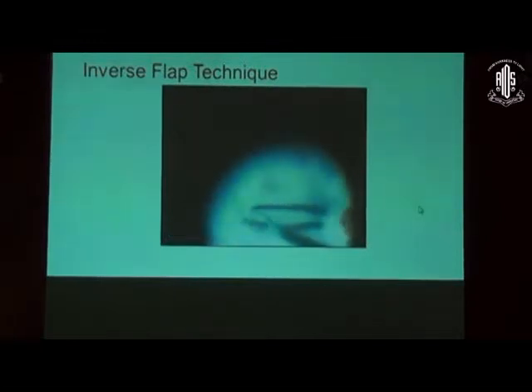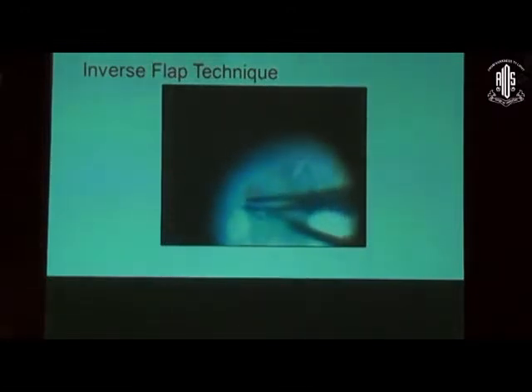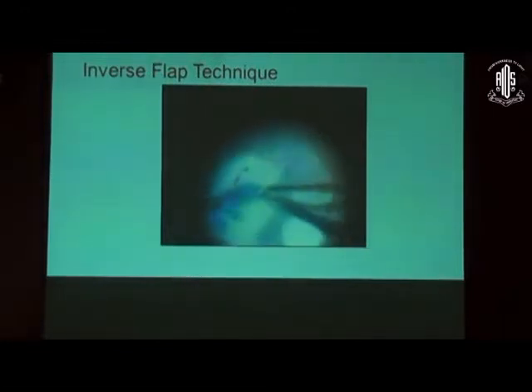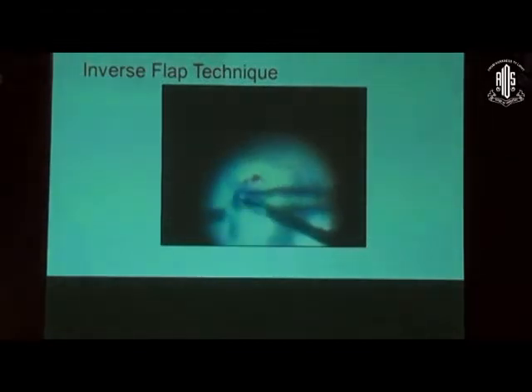So here we make the ILM peels just like a flower petal. So just make multiple peels. You go to the base so that you will have a nice flower petal appearance. So go up to the edge of the macular hole. So like this you can go all around the hole. And then bunch up all this ILM just like gentle stuffing into the hole. And then you can cut the excess ILM with the help of your cutter.